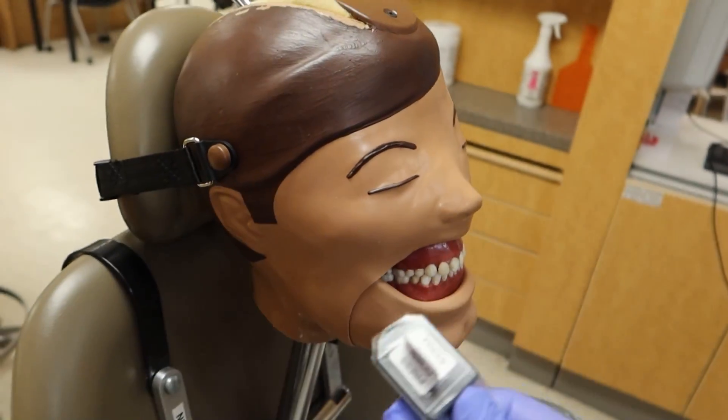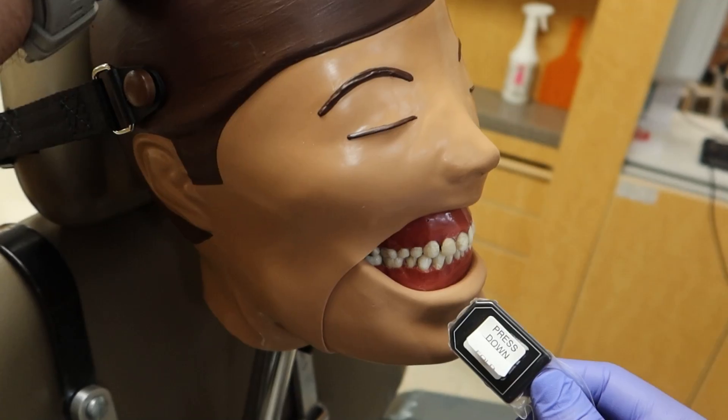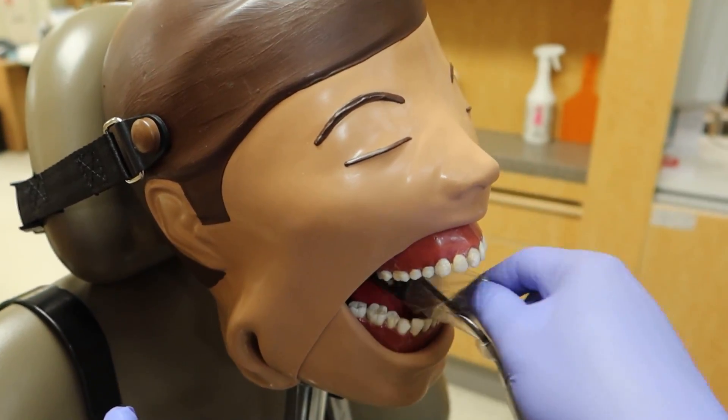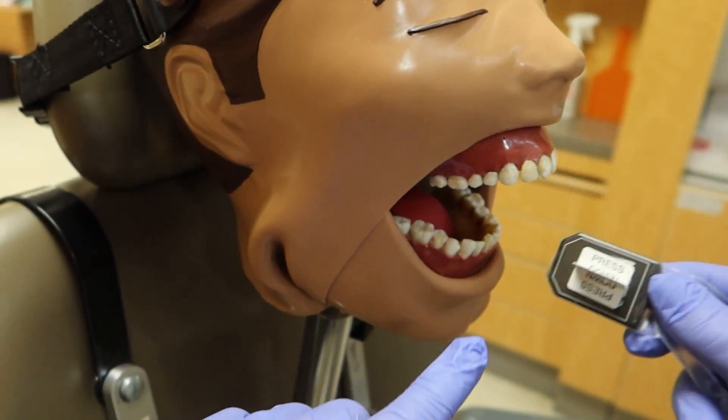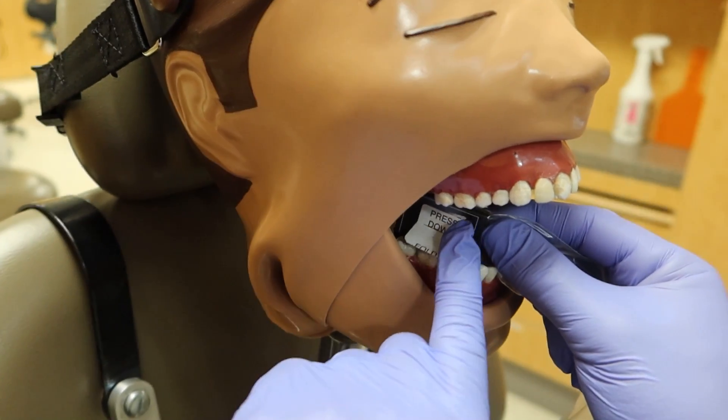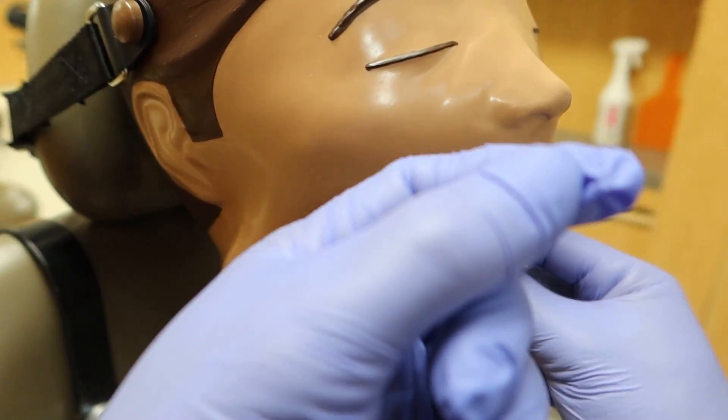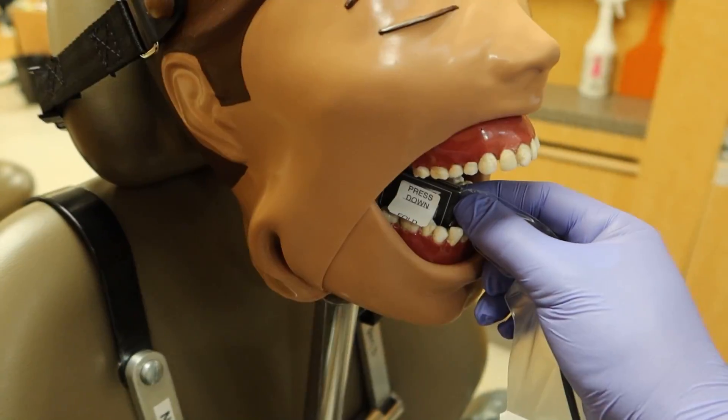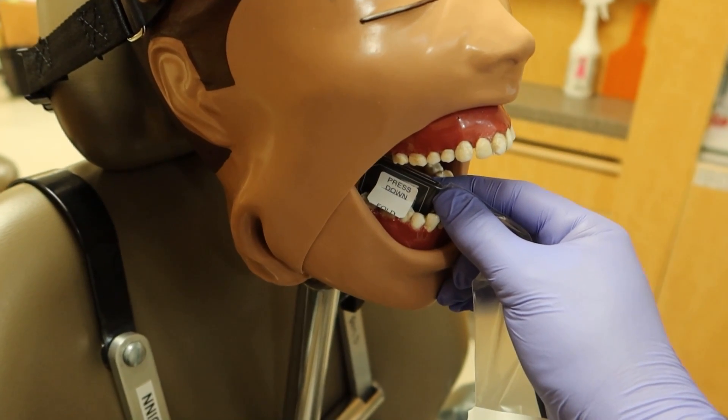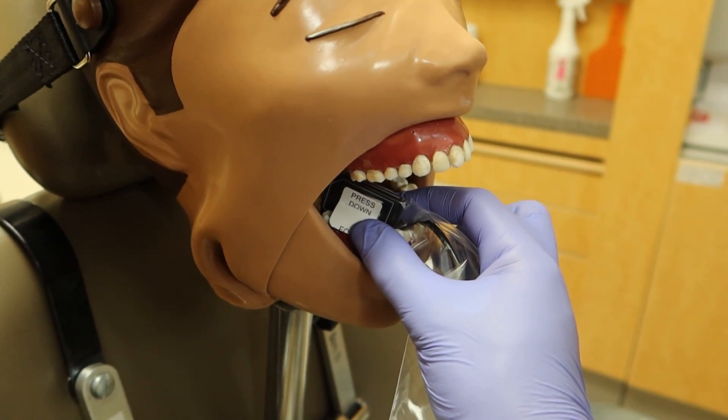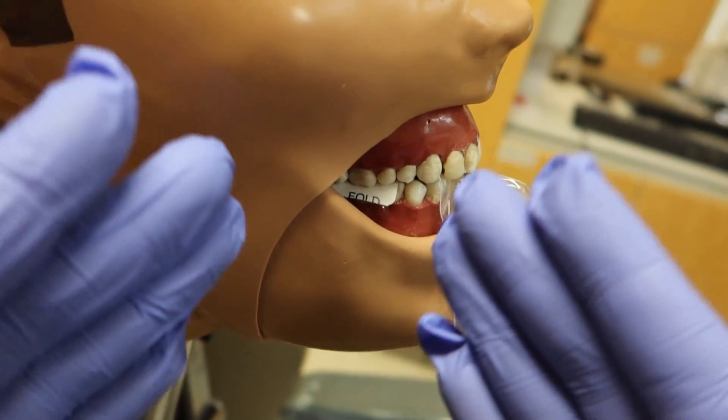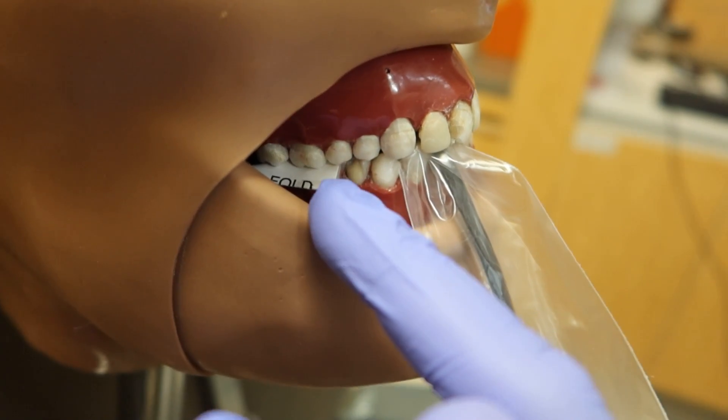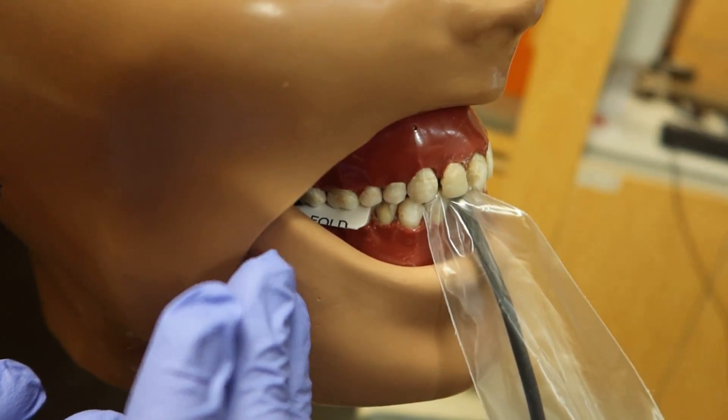So with that, go into my patient, just warn them, hey, we're going to take an x-ray of the teeth in the back. So I'm going to go ahead and have you open really wide. Oh, that's a pretty good one. And take your sensor and place it in there. Now you don't want to just go and jab them in there and have them go and swallow the whole bit, but you're going to want to place it carefully. With that, I can take my tab, place it in their mouth, getting in between the tongue and the teeth, and I can have my patient go and bite down. But you always want to tell them first the speed. You don't want to tell them to bite down slowly because as soon as they hear bite, all of a sudden you lose a finger. So I had to go ahead and hit them with the speed first, then the action. Hey, I'm going to have you slowly bite down right there. And as they bite down, hoping that they can claim some fingers of their own, I'm just going to be holding this in place and slipping my fingers out just in time. Now I go and look at where my actual tab is placed. As you can see, I have my tab far enough back where they're biting down on their second and their first molar and just a hair on their second premolar. That's okay. We can make that work. But now I have an idea on what to aim for.